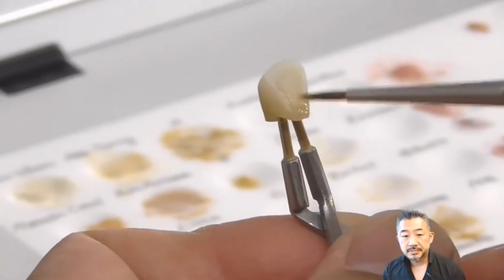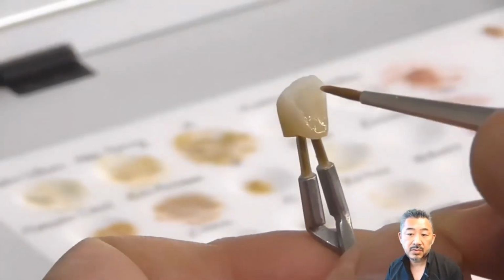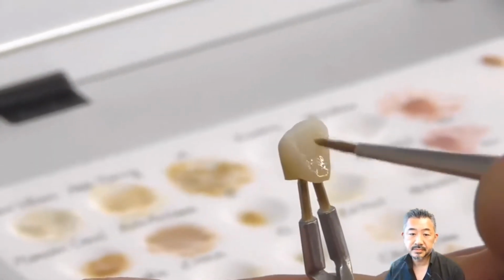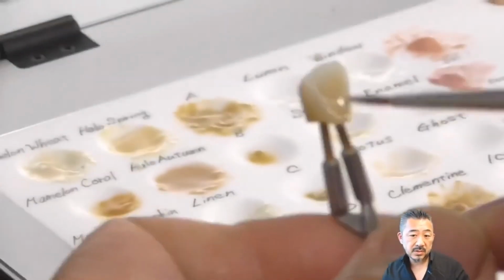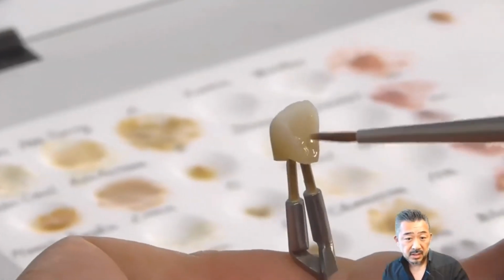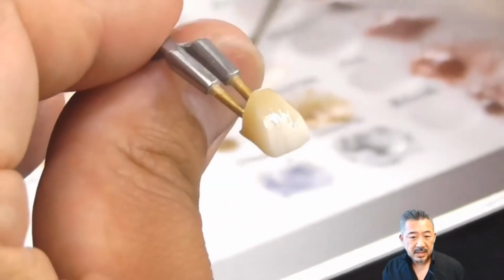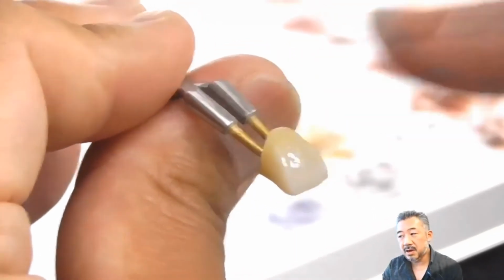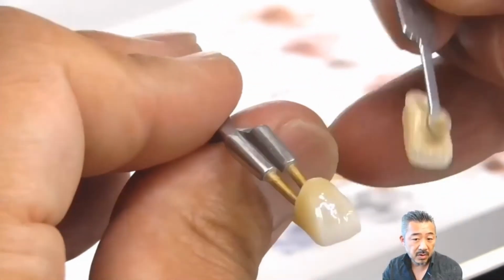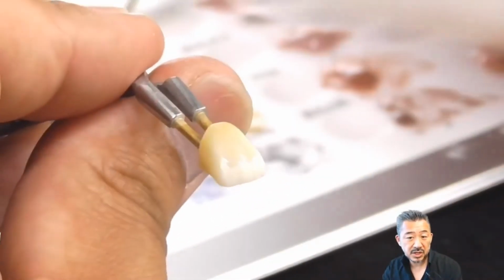So you can see now. Coloring changes depending on the color you want to reproduce. If you just want to reproduce the standard edge color, you may just apply glaze paste. No other colors are needed. Anyway, since I want to increase the brightness near the center of the labial, I apply warm color transparent paste. So let's check the edge shade tab.